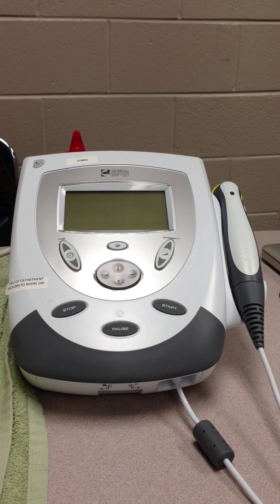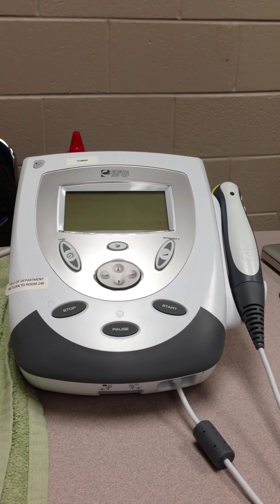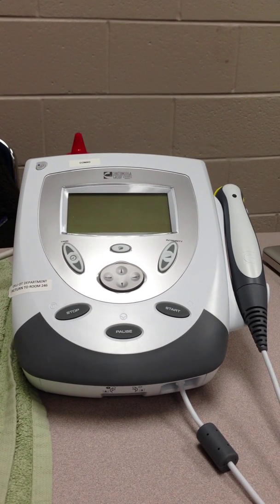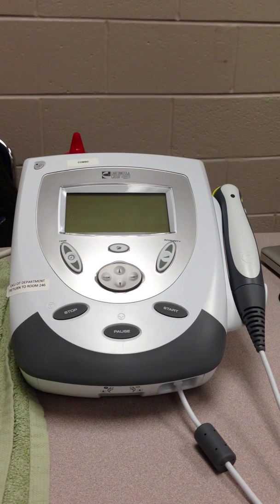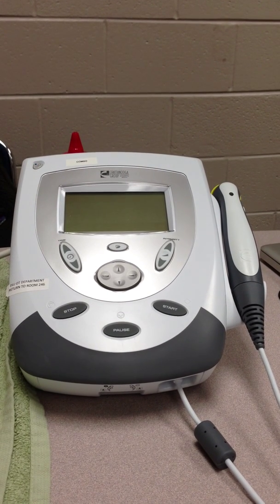thermal or non-thermal means. Ultrasound in the form of phonophoresis increases the permeability of the stratum corneum in the skin, allowing the medication to diffuse across it due to the higher concentrations and gradient pressure under the transducer. Medication is administered locally rather than systemically.